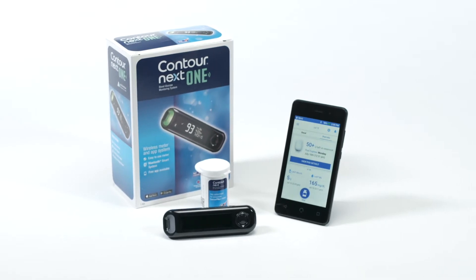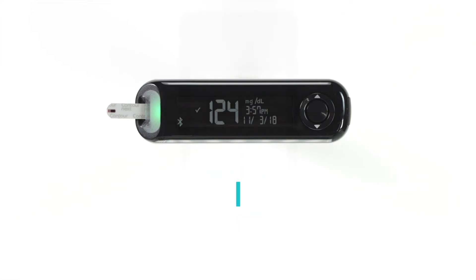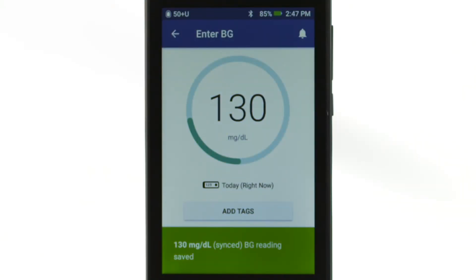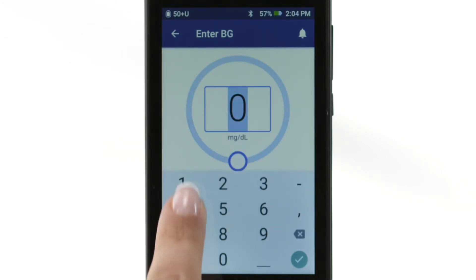You can use the CONTOUR NEXT1 BG meter to check blood glucose values as often as needed. Only readings taken on a paired CONTOUR NEXT1 meter will be transferred wirelessly to the PDM's bolus calculator. This includes historical BG readings that may not have been previously synced to the DASH PDM. BG readings taken on a different meter can only be entered manually.